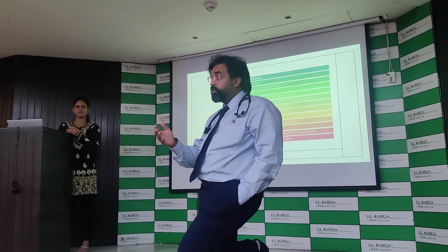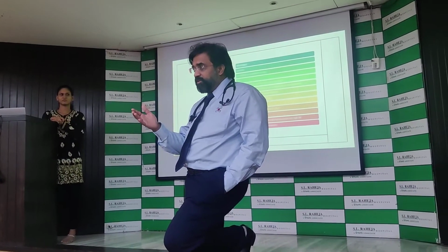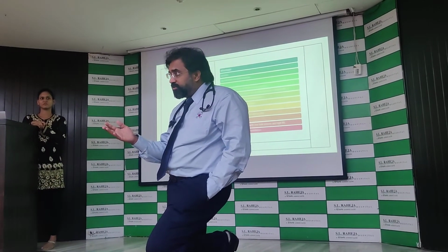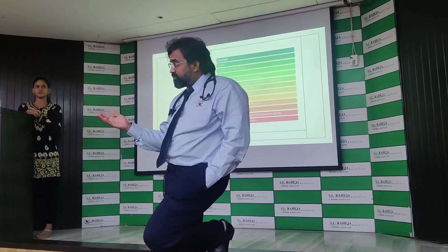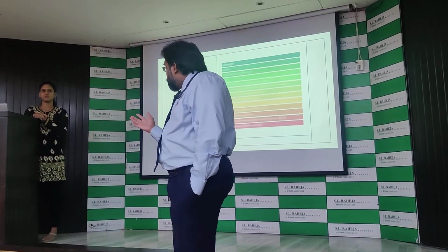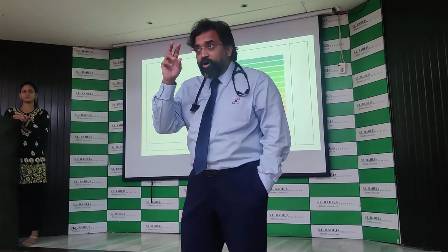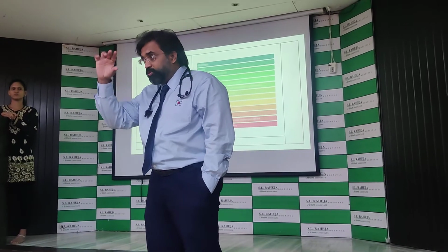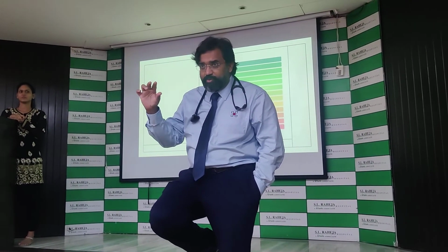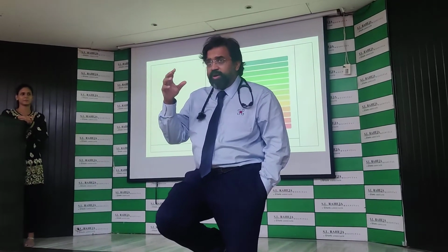Why did he become fast? Because we had extubated him, this particular patient. After extubation, what is going to happen? His PEEP is gone. So there has been a collapse in the lung, and that collapse has caused the compliance to reduce. Since the compliance has gone down, that box has changed from a normal box to a smaller box, a restrictive disease, an ARDS type. So it becomes restrictive. So the compliance has come down.